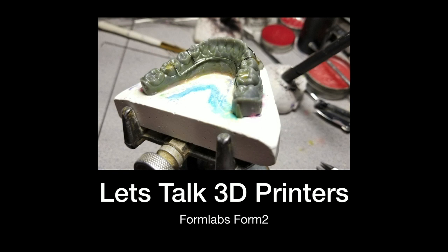I like to print horseshoe as much as I can. If I printed this whole base, it'd be a lot of resin. And resin is $150 per liter. So you want to save as much as you can. Notice I drain it, and then I try to pour it back in.